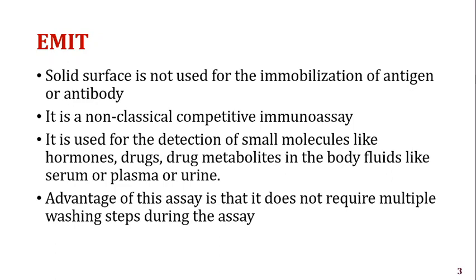It is used for the detection of small molecules like hormones, drugs, drug metabolites in the body fluids like serum or plasma or urine. Here, it can be used for two purposes. One, for the clinical investigation to diagnose a particular disease, where sometimes the endocrine glands may be malfunctioning, therefore the hormone levels in the body may be less or excess. So that's how the hormone levels in the body fluids can be detected.